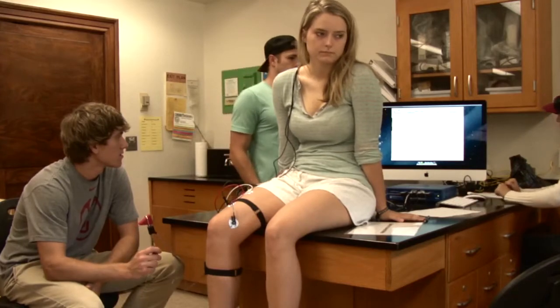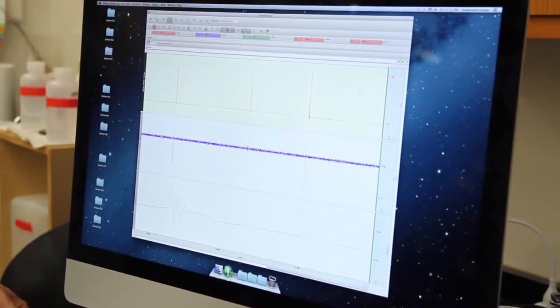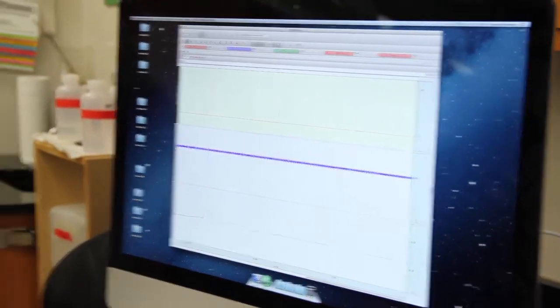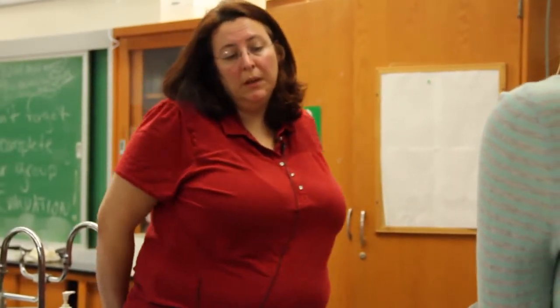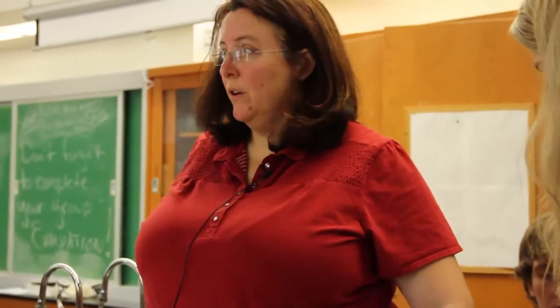Use the wide part of the hammer. That's pretty good — this is just a test. Go ahead and press stop. Now we want to look at our data. This is where you would get a TA to come over and evaluate the data. I would readjust that EMG channel because there's a lot of noise on the baseline — that is not an optimal tracing.